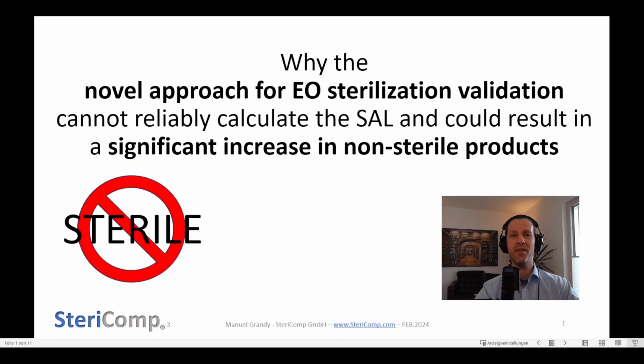Hello everybody, this video is about the novel approach for EO sterilization validation, which, instead of demonstrating the sterility assurance level based on a meaningful and reliable kill rate at the most challenging locations of the device, is rather relying on product tests of sterility without calculating a meaningful kill rate. But this I'm going to explain in more detail later.